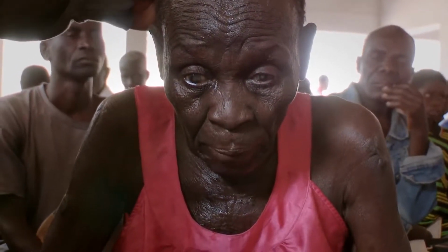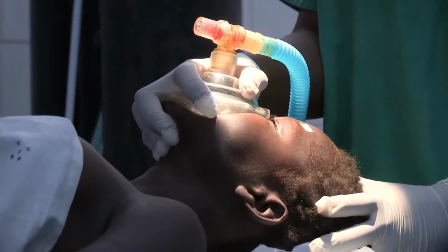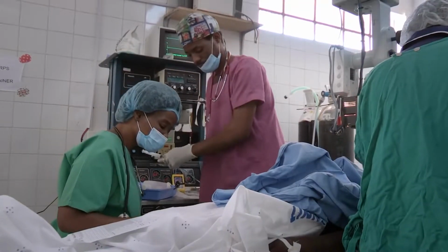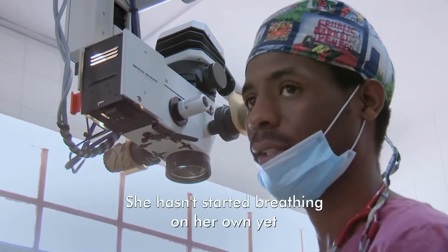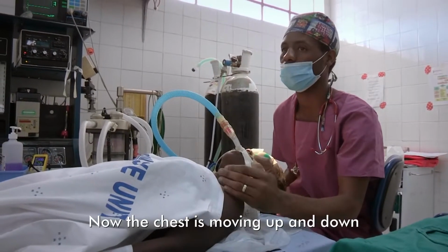Even in hospitals equipped with advanced instruments, the outcomes of surgery using an ultrasound phacoemulsification machine are worse than those of simple ECCE surgery, including severe corneal edema. In some countries, ECCE surgery is still mainly performed. However, cataract surgery instruments continue to be developed to reduce the surge phenomenon and to provide successful outcomes in a stable state by automatically controlling the intraocular pressure to maintain the pressure in the anterior chamber during the surgery.